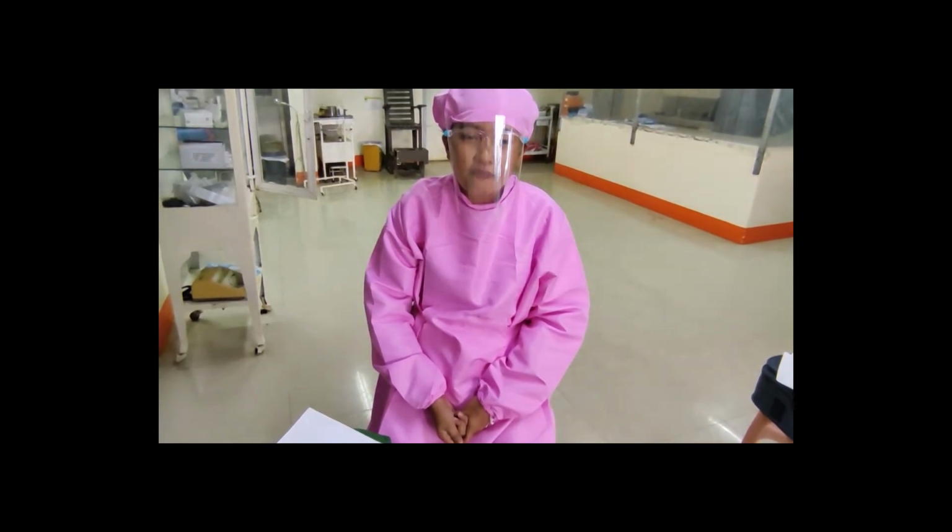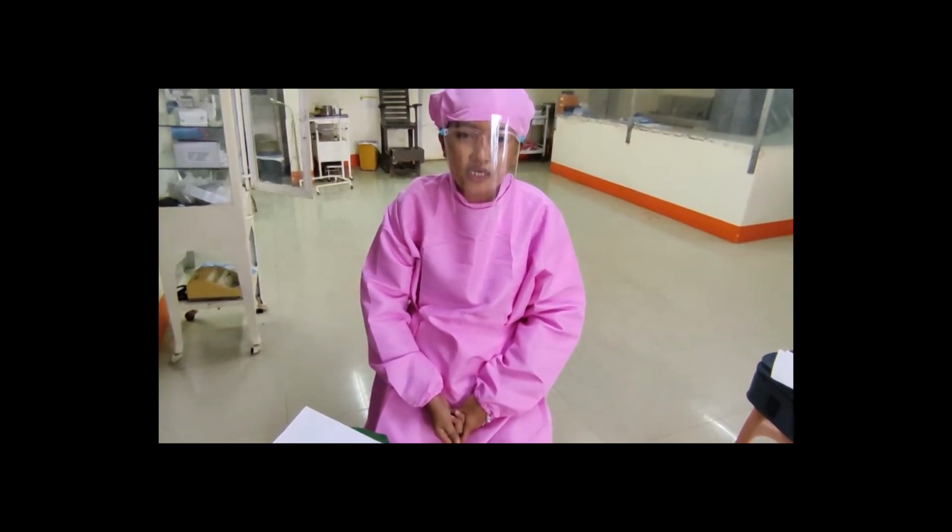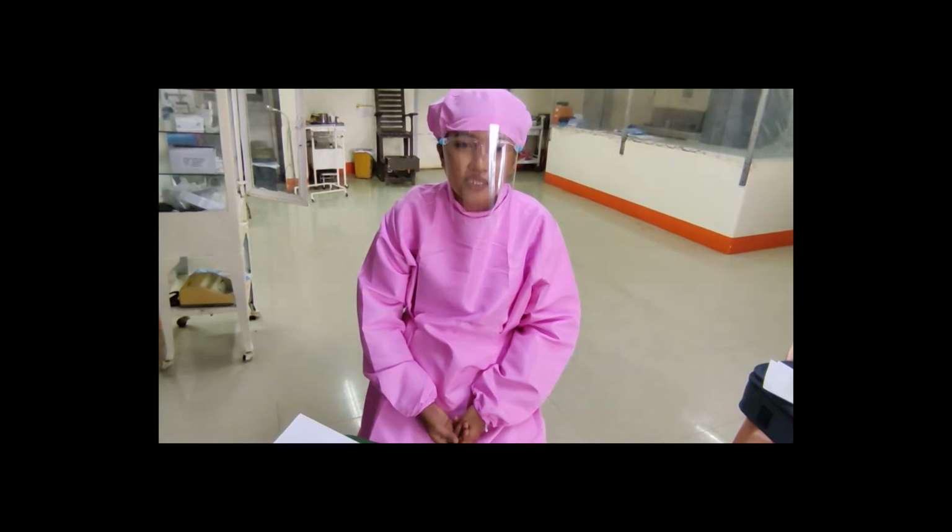If the baby's ear passed on the first session, first trial, then the final result for that ear is a pass. If that ear refers or fails, then a second trial is performed. If that result is a pass, then the final result for that ear is a pass. If it is a refer, then a third trial is performed. If the result is a pass, then the final result is a pass. If it is a refer, then the baby is allowed to rest for several hours. Staff criteria for inpatient screening.